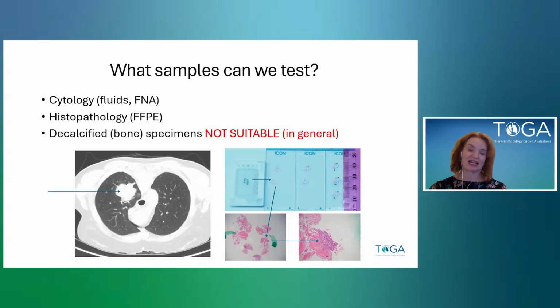This is just a clinical picture here of what might be a very large primary tumour or metastasis, but in fact we often get very tiny, 1 to 2 millimetre bits of tissue, and within those 1 to 2 millimetre samples we may only get less than a millimetre of tumour to deal with. So obviously the tissue is very precious. The procedures are not without risk, and we do our very, very best to do the best we can with these.